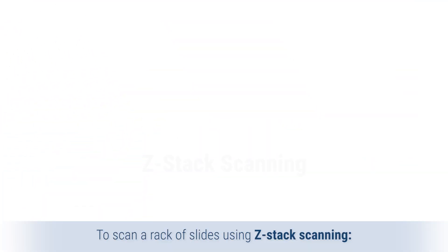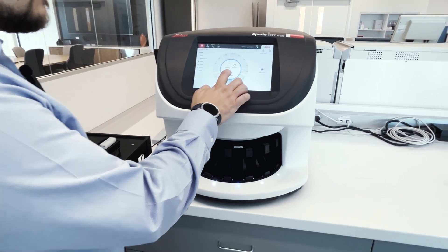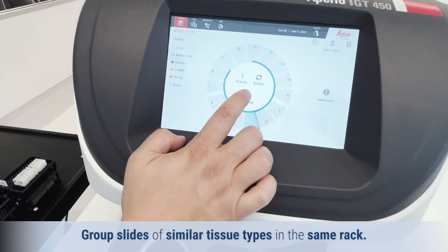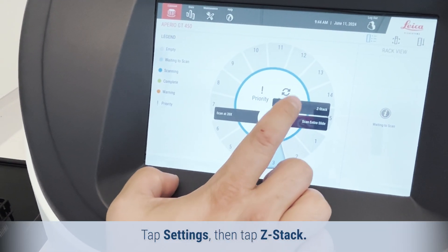To scan a rack of slides using Z-Stack scanning, load the rack with only slides to be scanned as Z-Stack images. Group slides of similar tissue types in the same rack. Tap the rack position that contains the slides, then tap Settings and tap Z-Stack.